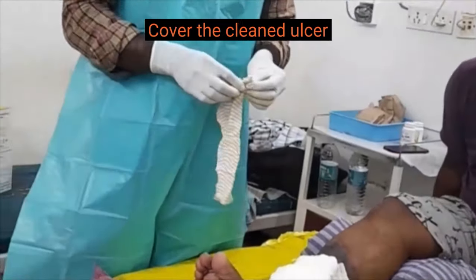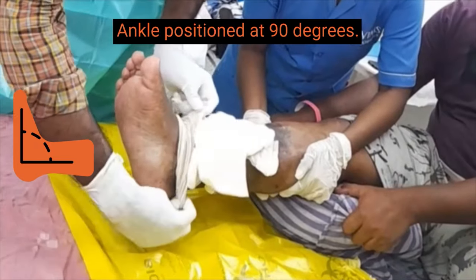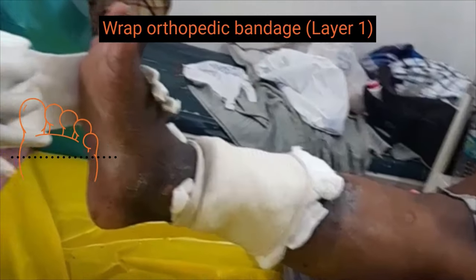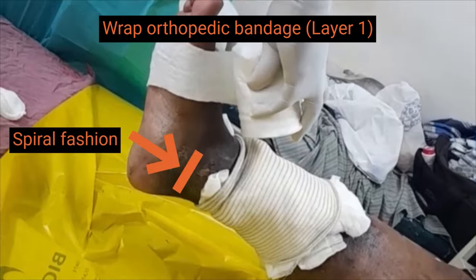The patient lies on the examination couch with the ankle at 90 degrees throughout the procedure. A plain stockinette will secure the wound covered. The first layer is an orthopedic bandage, wrapped around in a spiral fashion from the base of the toes to the ankle level.